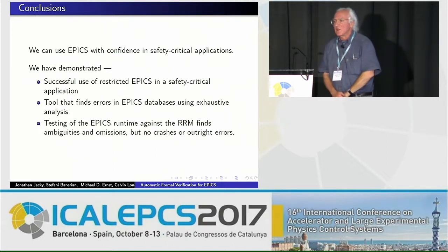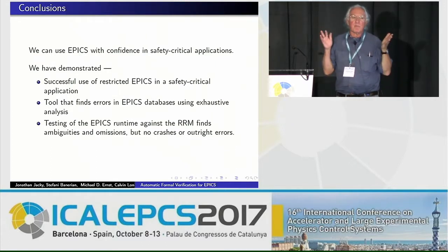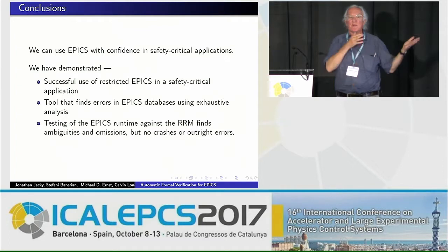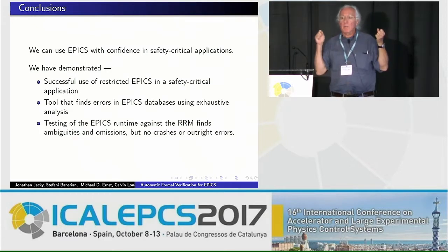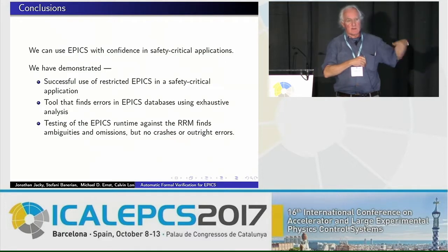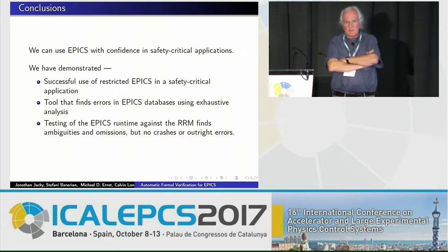Well, no, we didn't seriously evaluate anything else. I mean, we did evaluate a homemade C program running on VxWorks, because that's what the previous therapy control system that we'd used for 15 or 16 years was. And we thought, based on our experience with EPICS in the other parts of the accelerator, that it would be better than plain old C on VxWorks, which our experience has borne out.